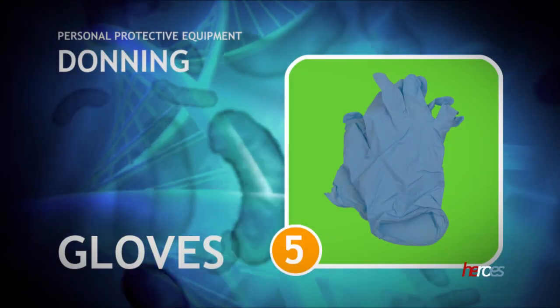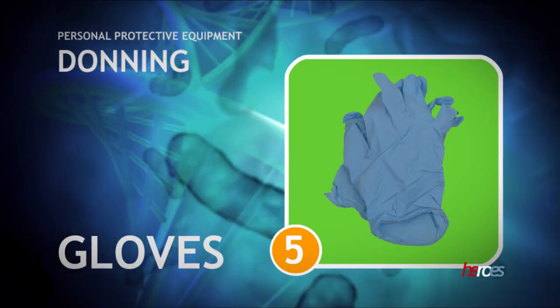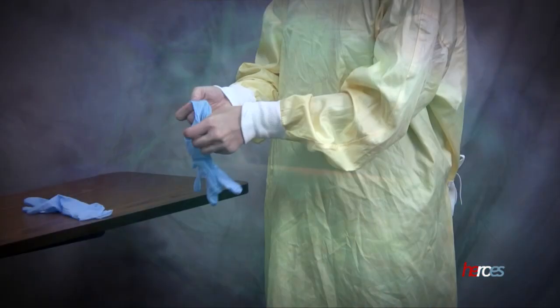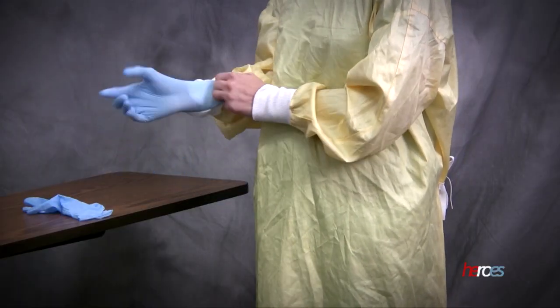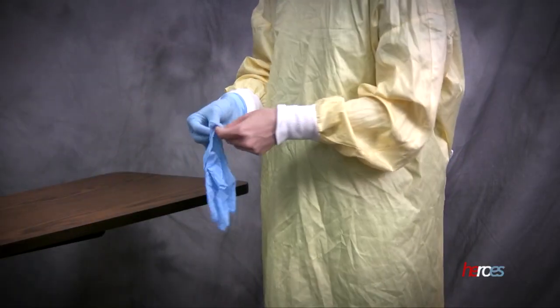The final step in the procedure is the application of gloves. Ensure that the cuff of each glove covers the wrist of the isolation gown. A secure fit will prevent gapping while providing care to the patient.